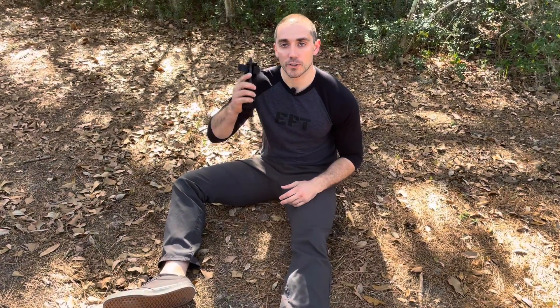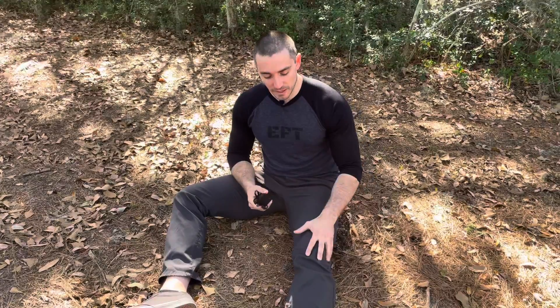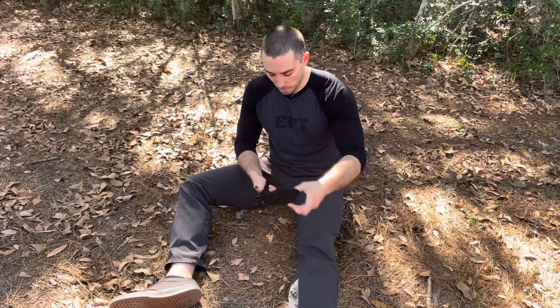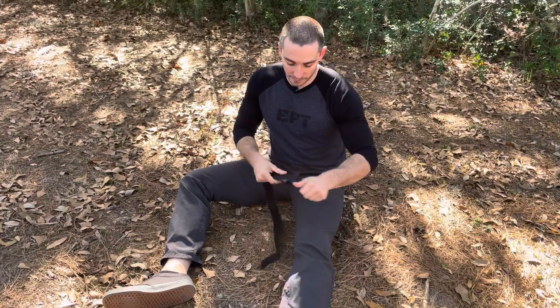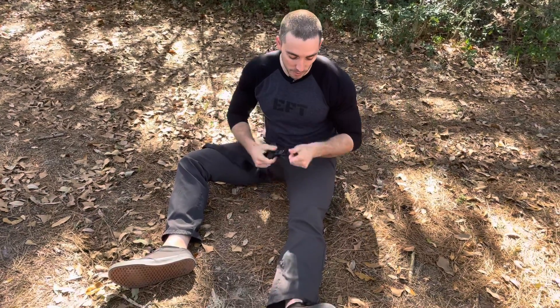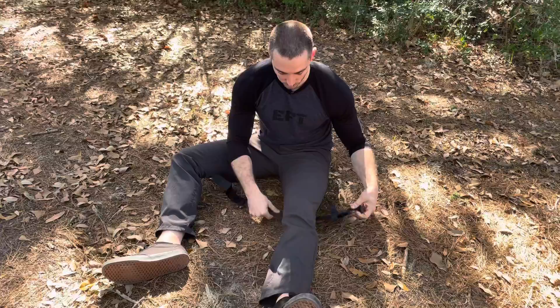We're going to go over tourniquet application to the lower extremity. Simulated injury: lower extremity that resulted in an arterial bleed. I'm going to take my pre-staged tourniquet and open it all the way up. The reason we do this is so we don't have to move the leg — if there is a catastrophic injury to the leg, we don't want to cause more damage or pain.